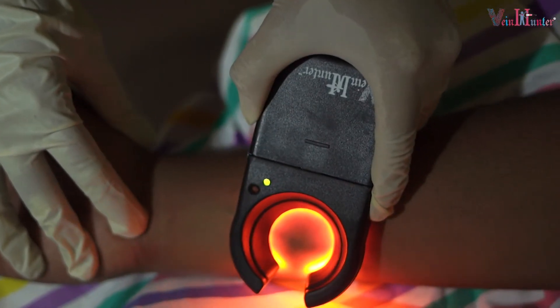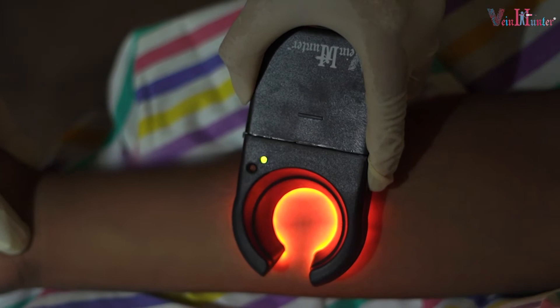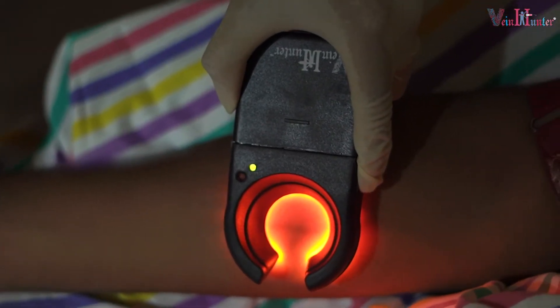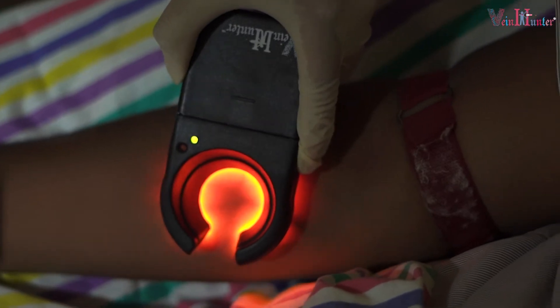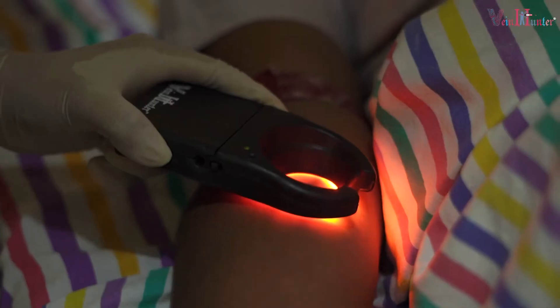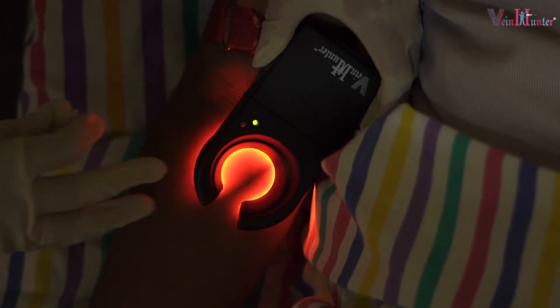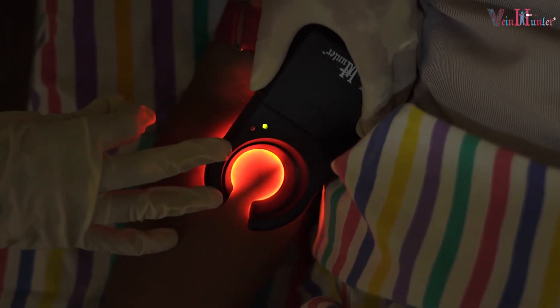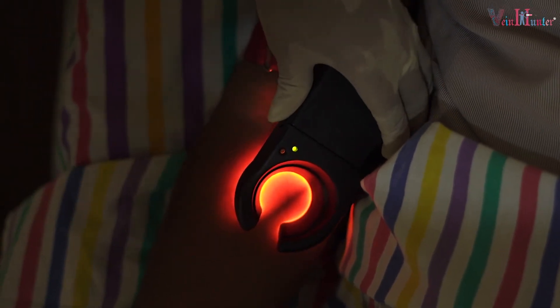When we locate the vein, follow it down. You can see a black line through the C-shape design and figure out which is the perfect area to put the needle in. Once we find the perfect vein, turn the device parallel to the arm and use your thumb to hold Vein Hunter while fingers wrap around the arm for secure one-handed use.